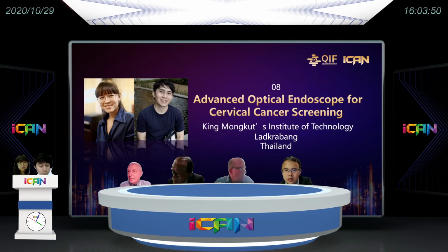So until now we have just finished the imaging part. We expect to see the cellular structure at micro scale at the end of the fiber bundle. But for the fluorescence dye, we are still working on developing the peptide that can fluoresce the cervical cancer cell.